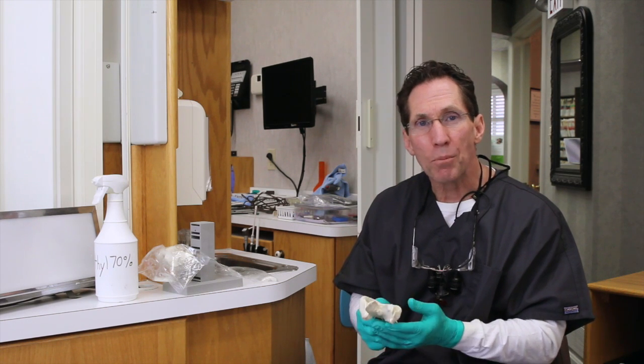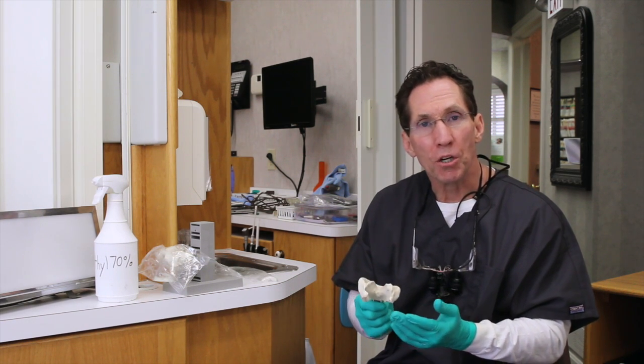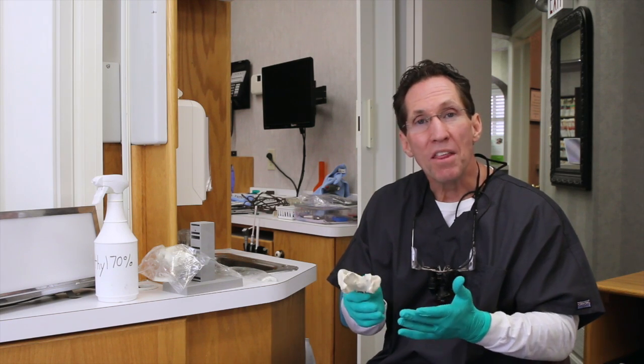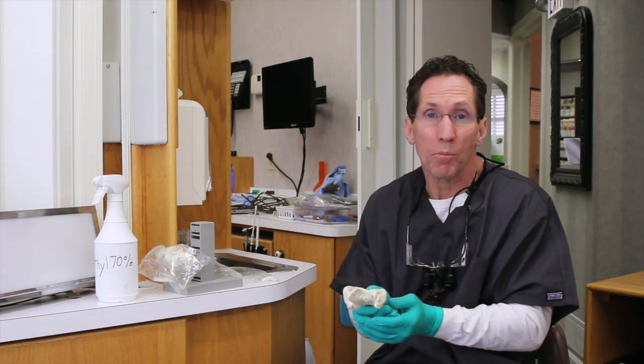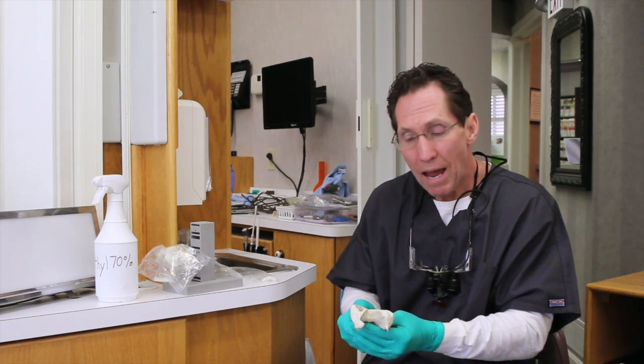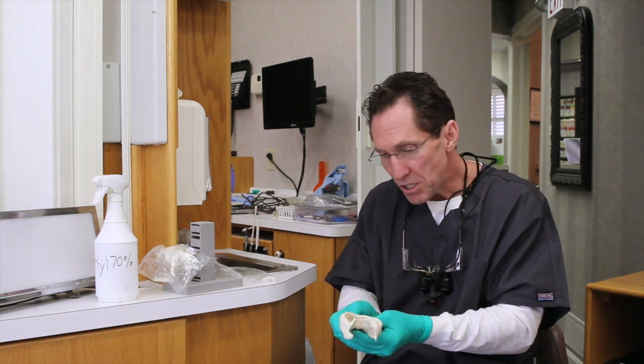Okay, now that we have an accurate impression, what do we need to do to ensure that the casts that we make from this impression retain that accuracy, that we have accurate casts, because ultimately that's what it's about. It's not the impression, it's the ultimate cast. And so here we have Debbie's lower arch impression, as you can see here.